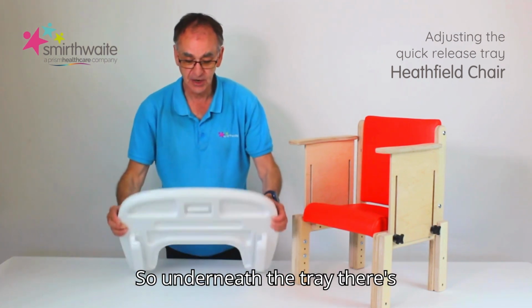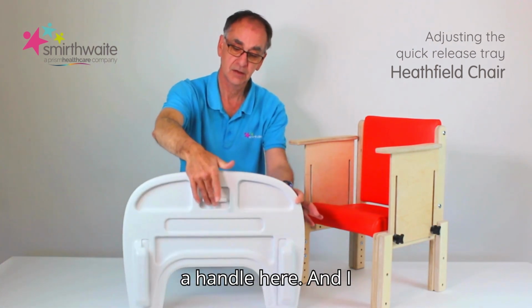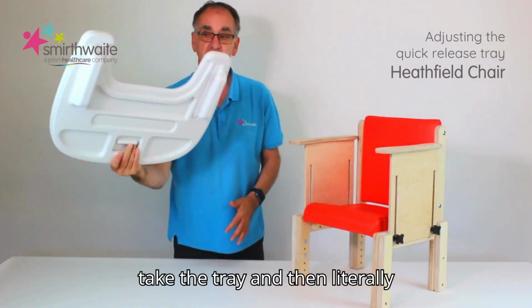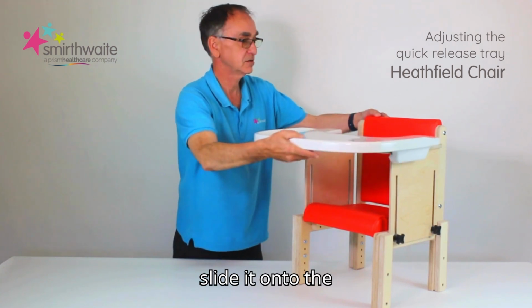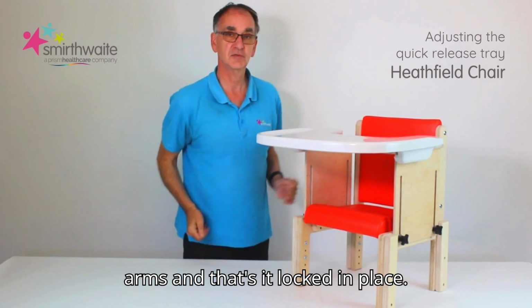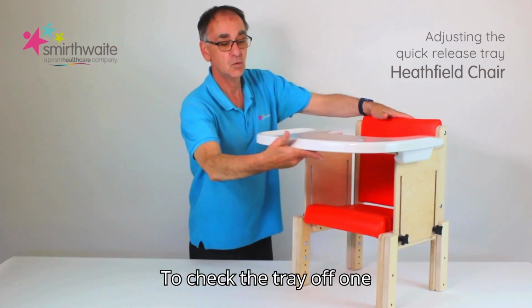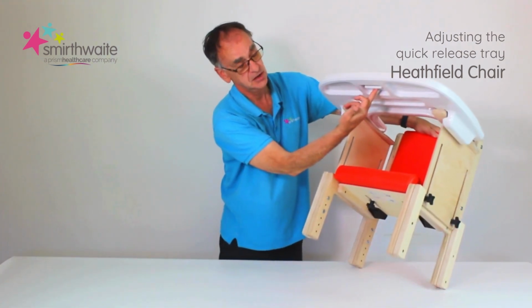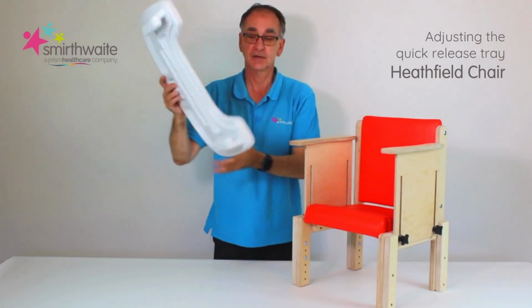So underneath the tray there's a handle here, and I just need one hand to do it. I can take the tray and then literally slide it onto the arms, and that's it, locked in place. To take the tray off, one hand, pull the lever underneath, which is here, and remove the tray.